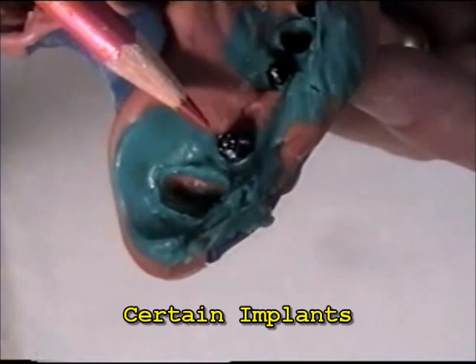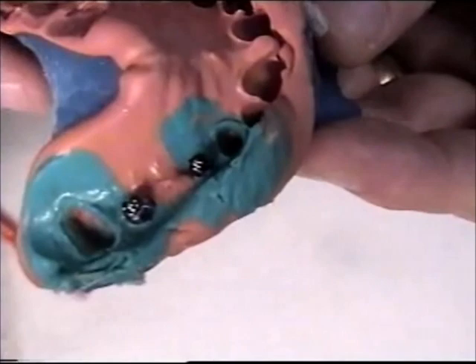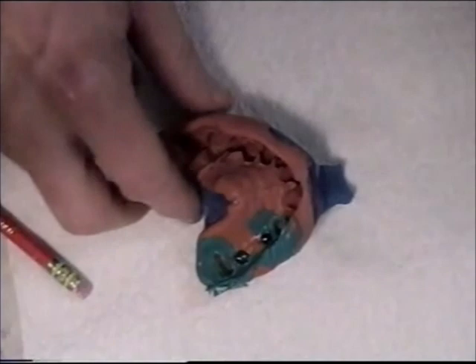3.4 is here. 4.1. And I'm going to have to make a soft tissue model. So I'm going to be pouring some silicone around these, and I'm going to be demonstrating that today. So I'm getting my parts together, and I want to kind of explain what's been done already here.